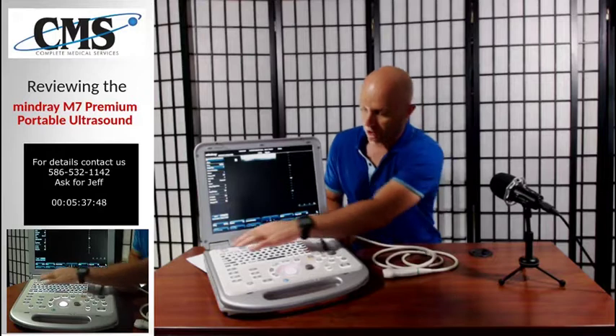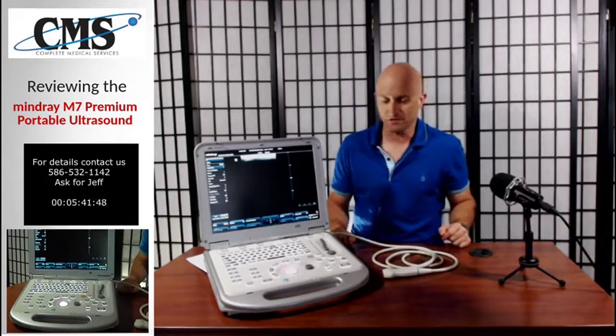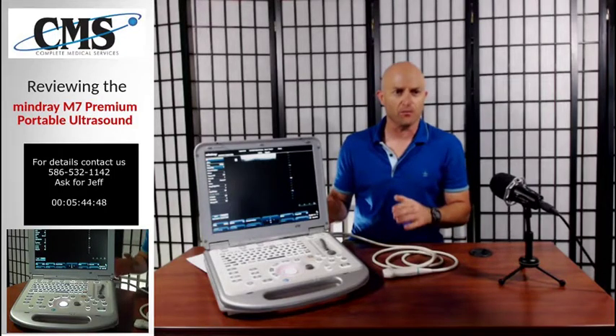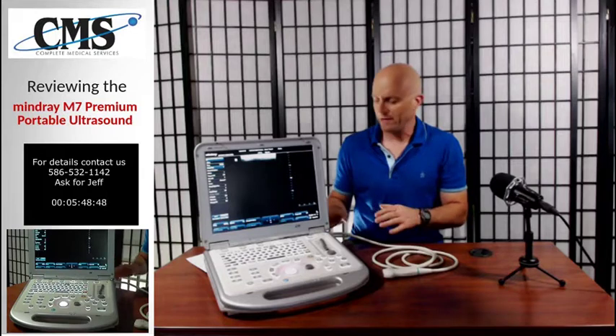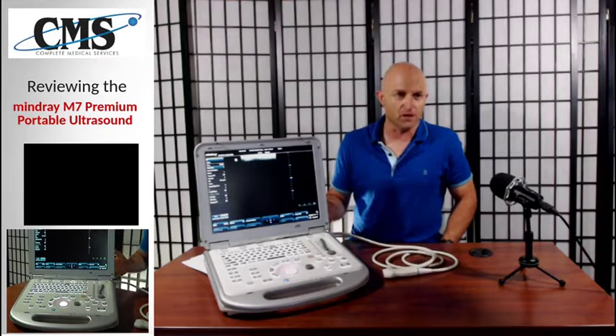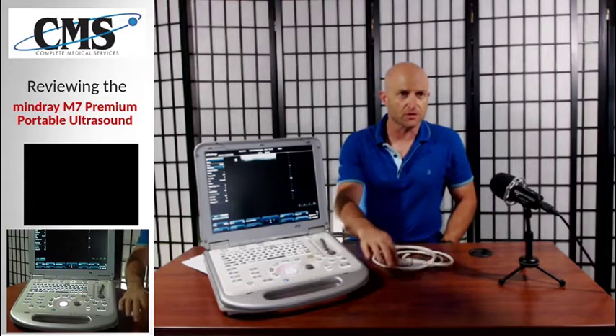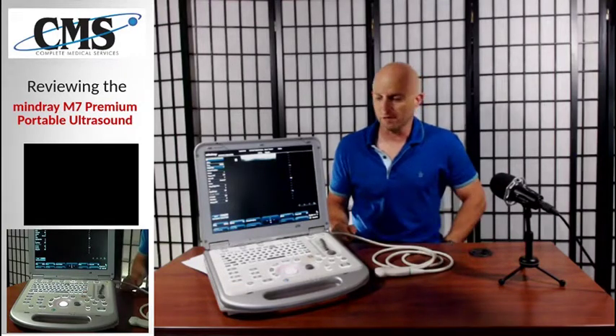You have your soft keys up here, which are also very easy to adjust and to use. Overall, the M7 is a great budget ultrasound — it provides good image quality for the price point. It also includes a five-year warranty, which is fantastic. The warranty covers all software updates, the transducers, and also the parts and labor for the ultrasound.